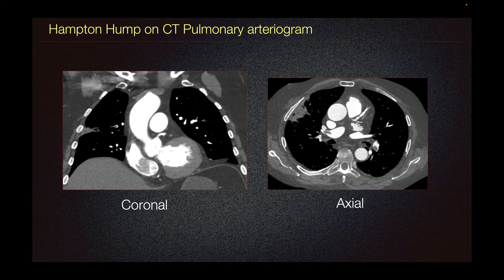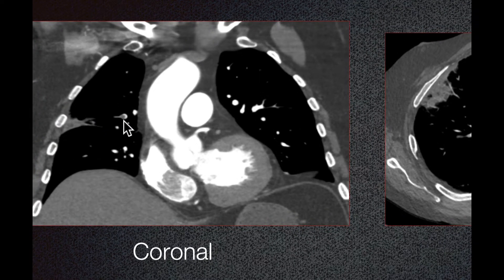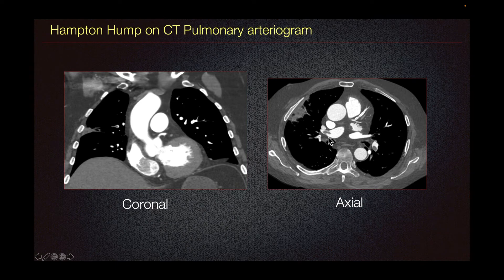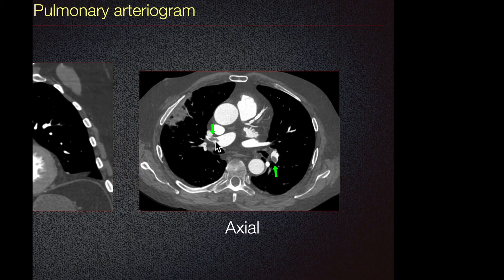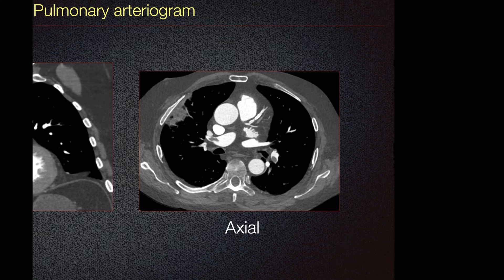Hampton's Hump on CT Pulmonary Arteriogram. In our coronal reformat, we can see a pleural-based opacity in the right mid-lung. We can see a filling defect within the pulmonary artery consistent with pulmonary embolism. On our axial imaging, we can see filling defects in both the right main pulmonary artery and the left lower lobe pulmonary arteries. Just peripherally, we can see this pleural-based rounded opacification consistent with pulmonary infarct associated with pulmonary embolism.